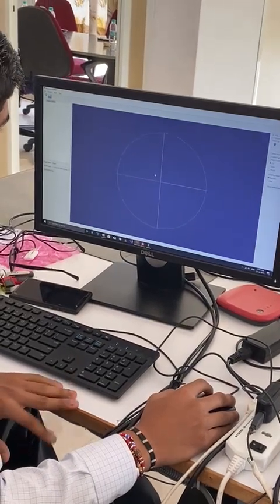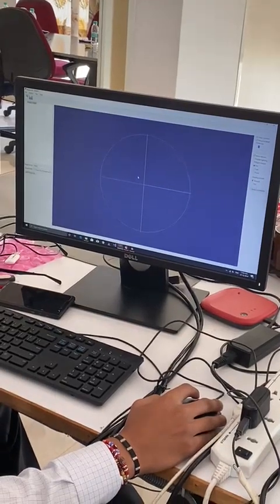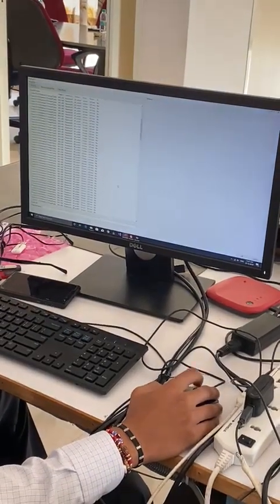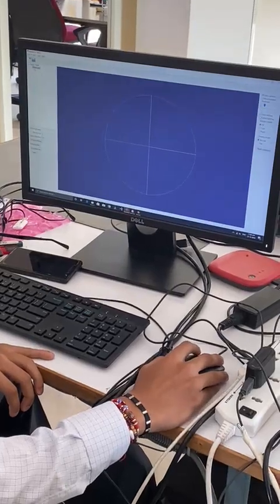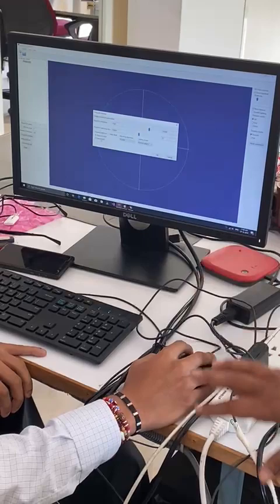remain the same. We are going to mask this particular GUI, whatever we are seeing manually, and we will have only one click where we will start the automation. The pictures will be automatically taken. Only the PLY generation will be shown to the end customer. So all these things we have already automated. We have a POC also for that.